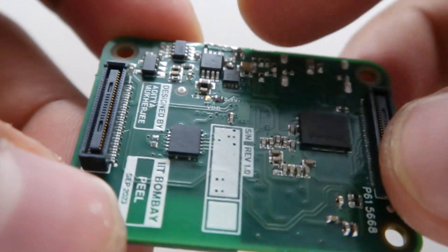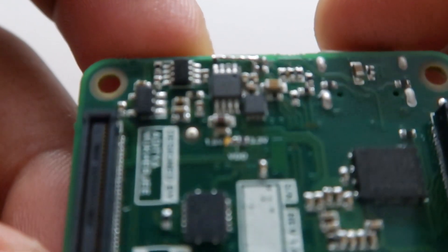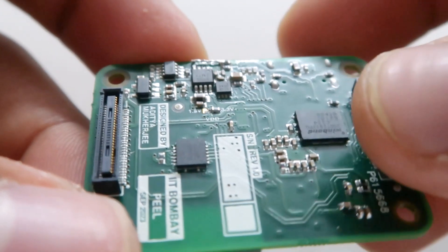There's a level shifter, which comes in handy if you are using the board at 1.8 volts, and then you have the flash memory for the RP2040.